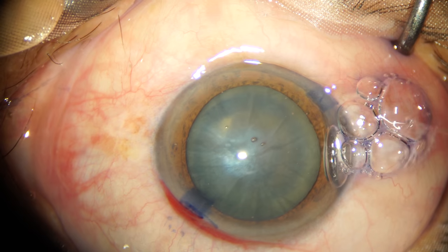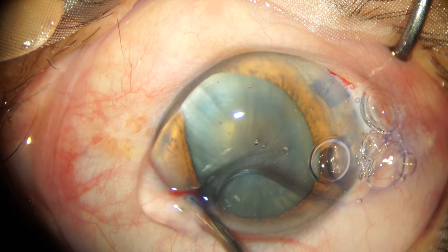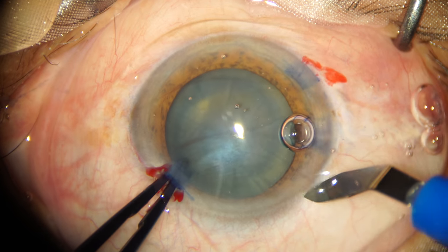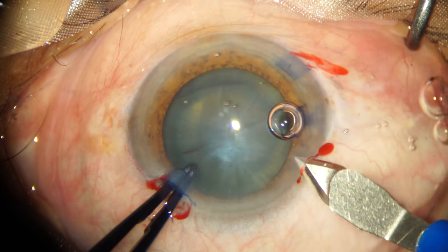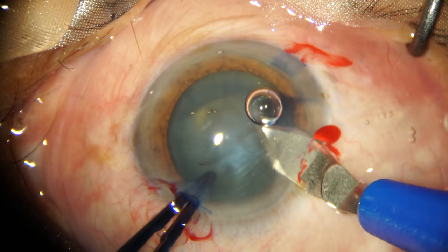After I have stained my anterior capsule with 0.06% trypan blue, I move ahead to make the main incision. My preferred choice is a triplanar 2.8mm main incision, and I usually make the incision on the steeper axis.